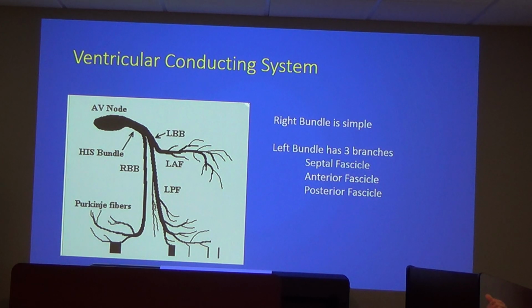And so you actually lose that in a true left bundle, you lose that little R wave in V1 and that little Q wave in V6 because you don't have that little conduction down this little one right here, which is always an interesting thing.